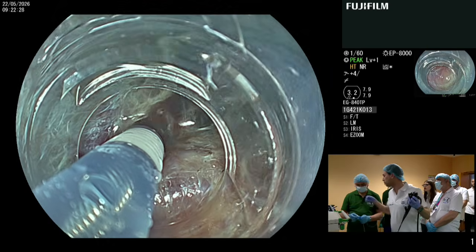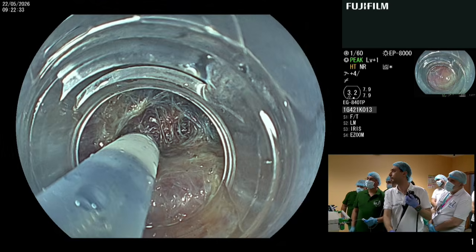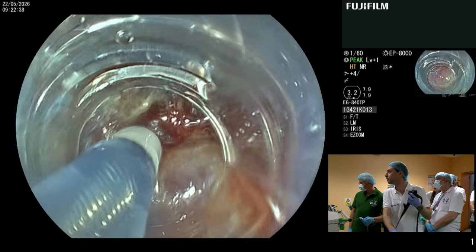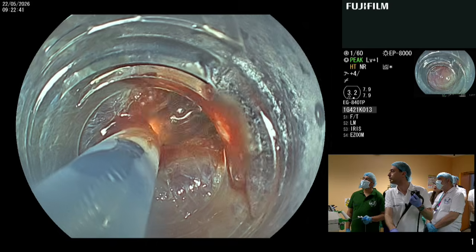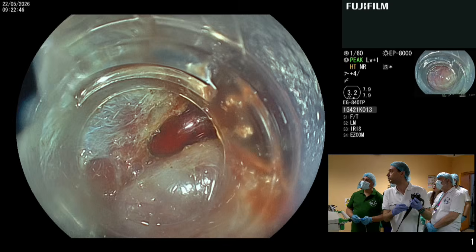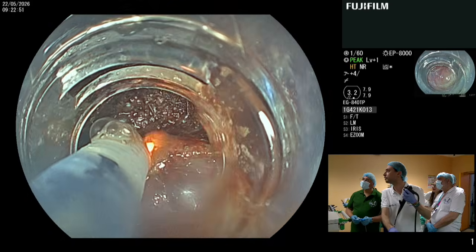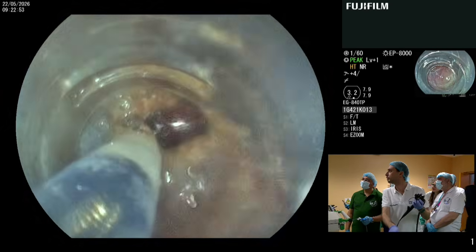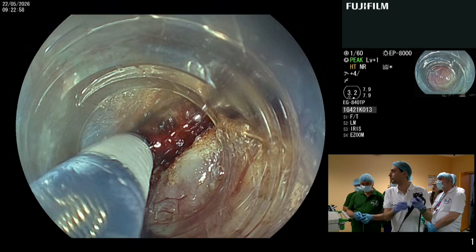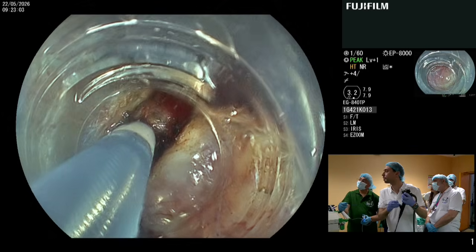Okay, now I will switch to spray coag. I have multiple settings ready. So we have a major vessel here, and I use a more aggressive current. I have just to identify the vessel. Madalena asked me to show you blood and fat. If I don't succeed, I will use the coag grasper. It's slowed down. I will inject again to identify the vessel. Okay, the oozing comes from here.